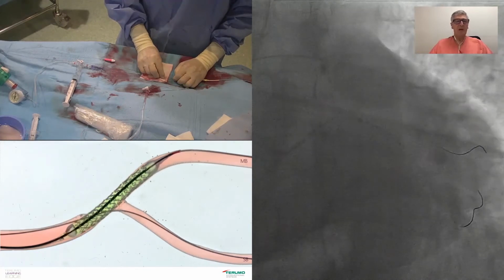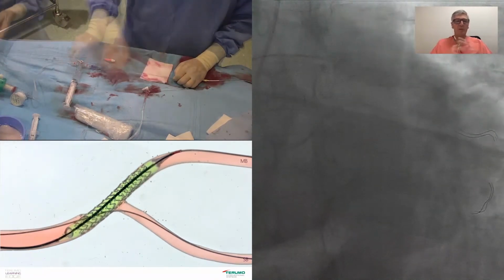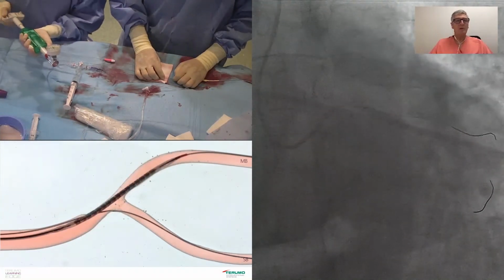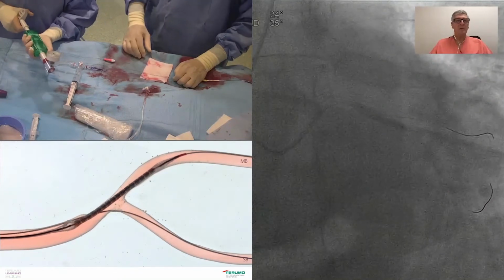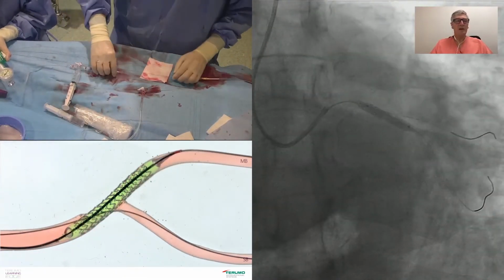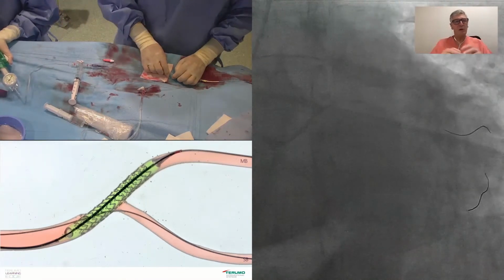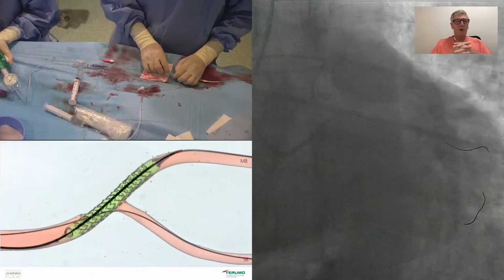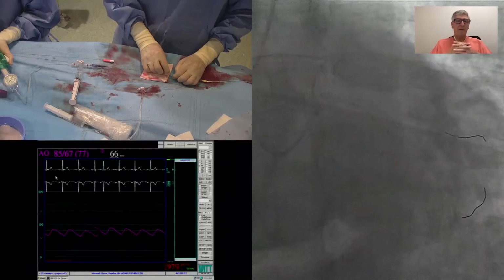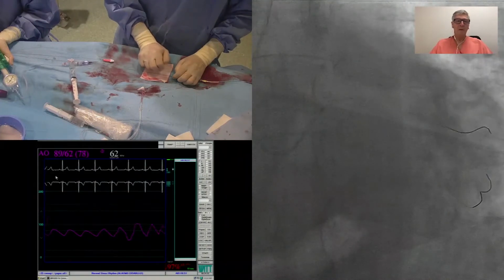I think time is very important also to have a full expansion of the stents. I like to do 2 dilatations because I always see a further expansion in the second. Always I do 2. Yeah. And you know, we learned from Gérard Finet that when you do a second inflation, the balloon is a little bit bigger at the same pressure. Yeah. So it increases a little bit the size of the balloon. Exactly. We are going to 12, 14, then we're going from 3.6, 3.7.